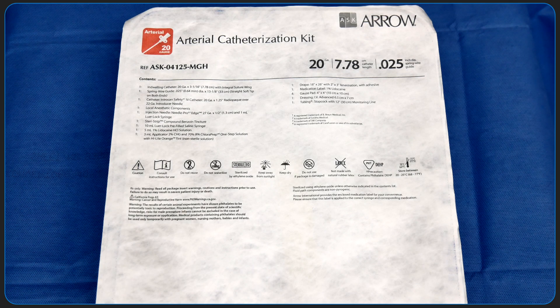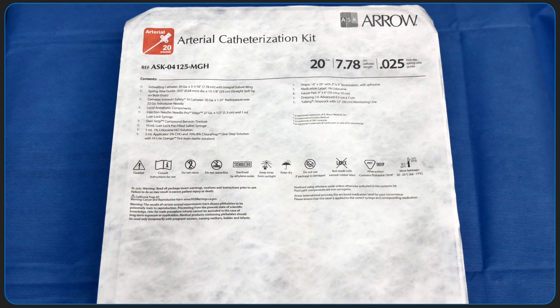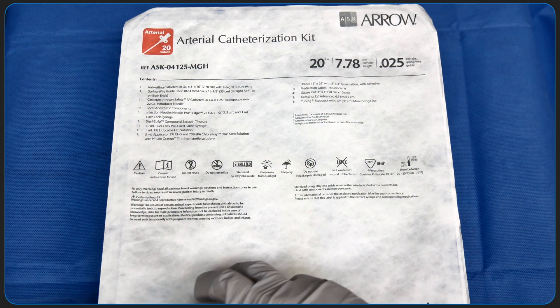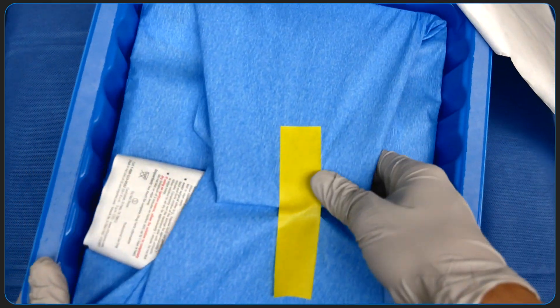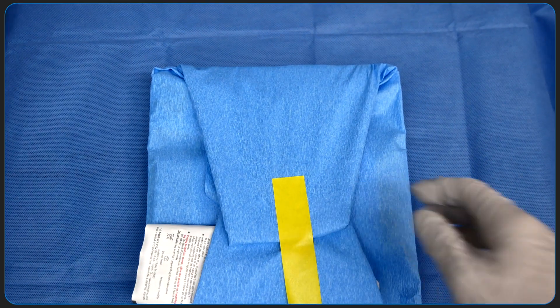In this video, I'm going to demonstrate how to set up for insertion of an arterial catheter. At our institution, everything we need is conveniently packed together in an arterial catheterization kit. I'll show you what all the individual components of the kit are and we'll chat about what everything is used for.